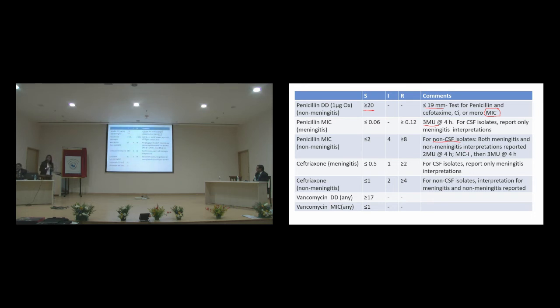Why? Tell why. Yeah, we don't know that the meningitis may be there or may not be there. Okay? So this is particularly important for blood. This is about the penicillin.